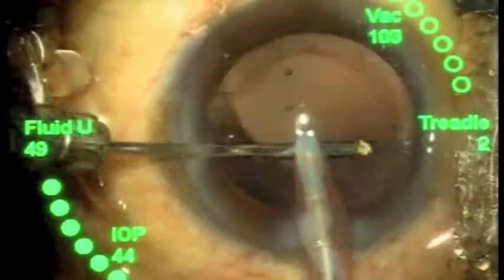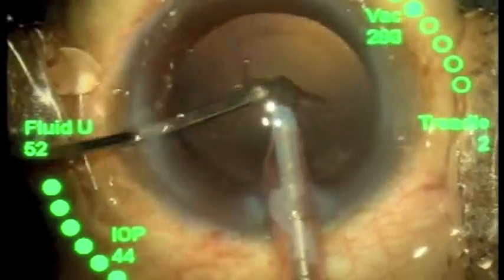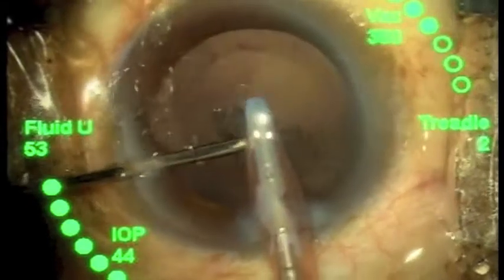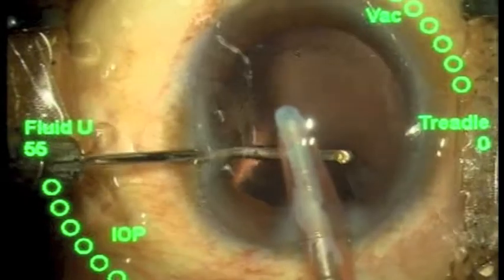The setup will be illustrated a little later, but the aspiration function is controlled by way of a three-way tap to switch between aspiration from the main or the side port handpiece.